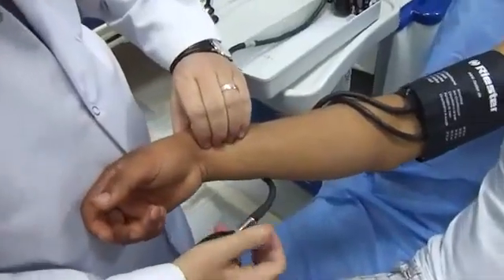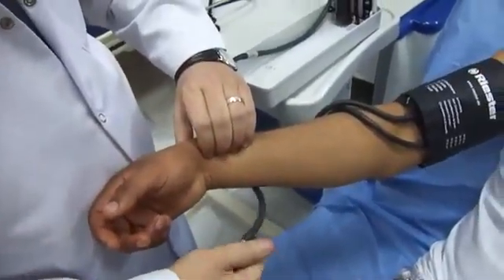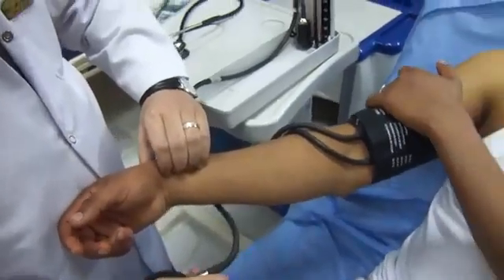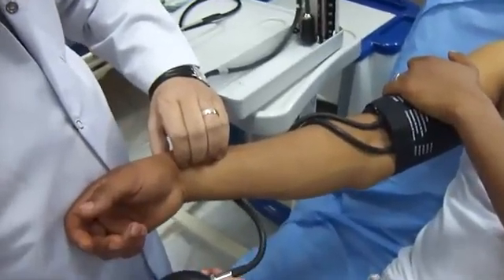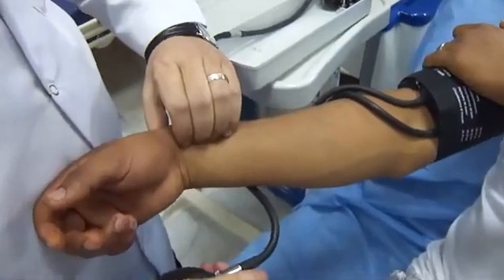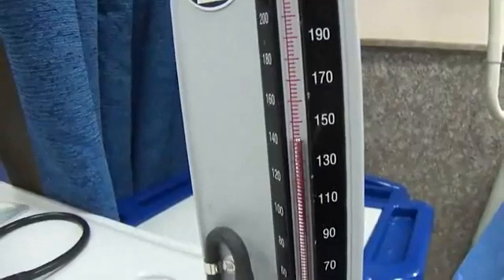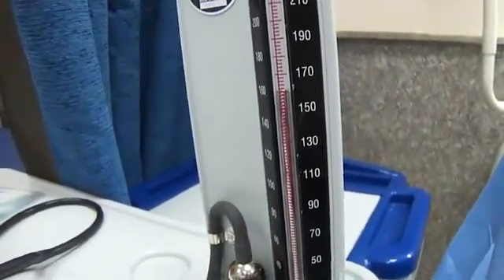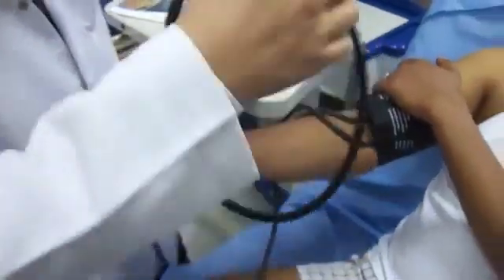I'll encircle the sphygmomanometer cuff and raise the blood pressure until the radial pulse becomes impalpable. Now the radial pulse is impalpable — I'll raise the column about 30 millimeters of mercury further, and then I'll listen with the stethoscope over the right brachial artery.